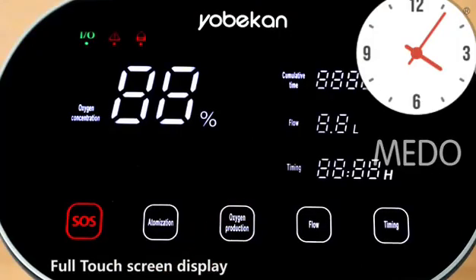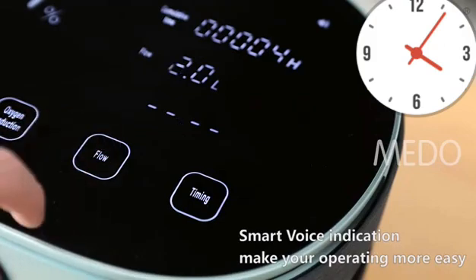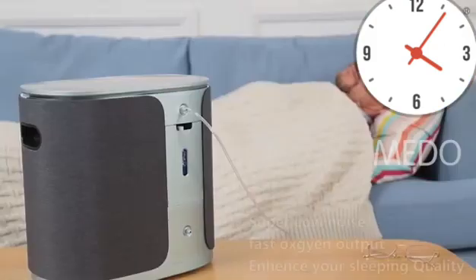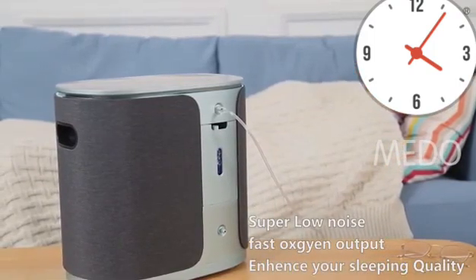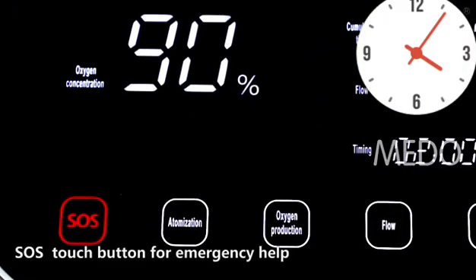Full touch screen display. Smart voice indication makes your operating more easy. Super low noise, fast oxygen output to enhance your sleeping quality. Plus a touch button for emergency help.